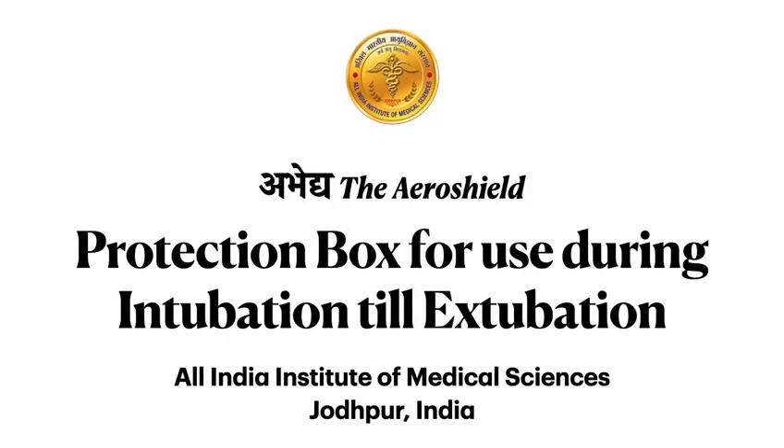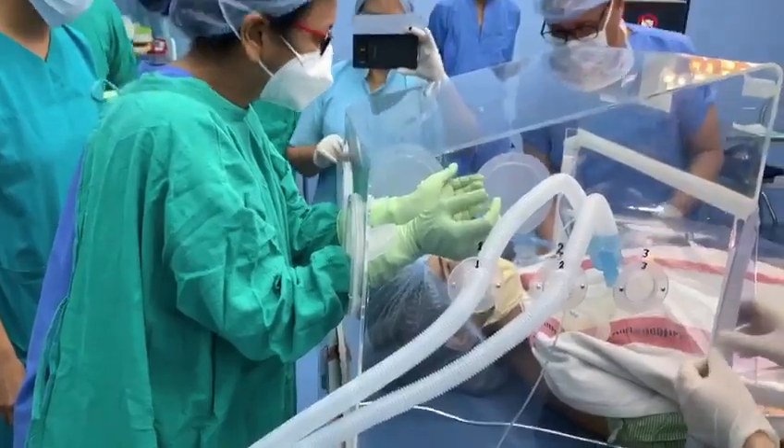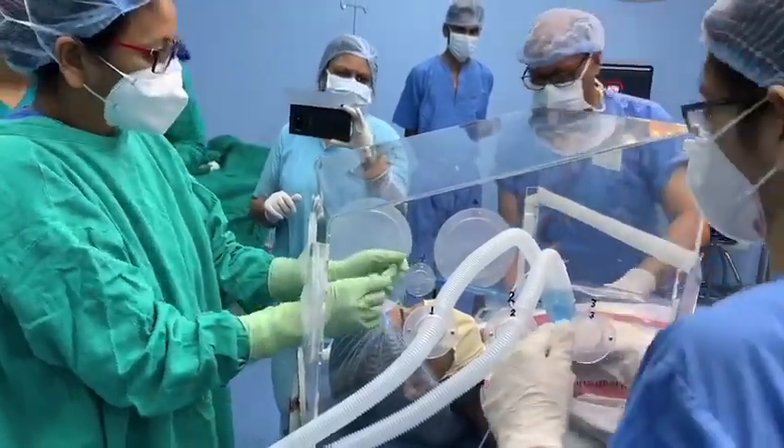A team from All India Institute of Medical Sciences, Jodhpur, has developed a novel protective box for use during endotracheal intubation till extubation of the patient. Here are a few salient features of the box.